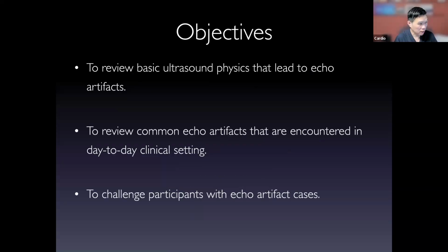So the objective today, we're going to talk about the basic ultrasound physics that lead to echo artifacts, to review common echo artifacts that are encountered in day-to-day clinical setting, as well as to challenge participants, which are you, with echo artifact cases, and see if we can figure it out. So feel free to type it in the chat box so we can follow along and see what you think.